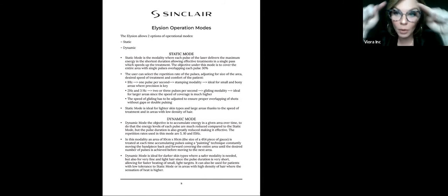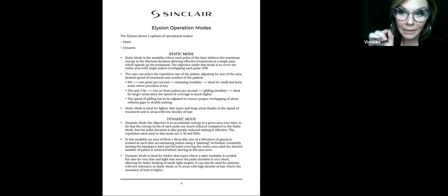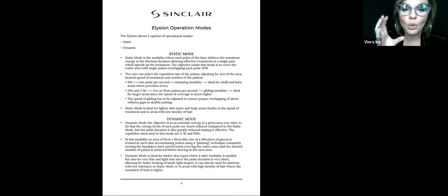So 4 by 4. And it's really important, and good practice if you're treating something like a woman's legs, to always have a white eyeliner pencil and mark out the size of a traditional 4 by 4 piece of gauze, and then follow that pattern throughout the legs. Otherwise, you sometimes end up trying to do too large an area and you're not accumulating the heat that you need. So what the dynamic mode does is it moves quicker.